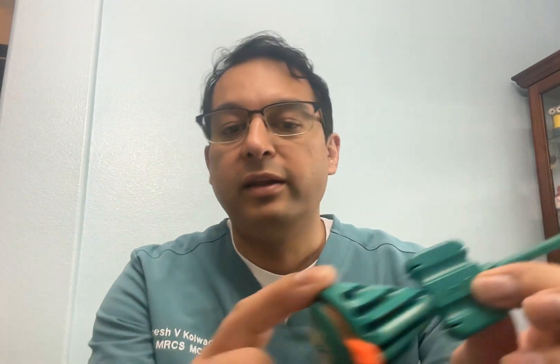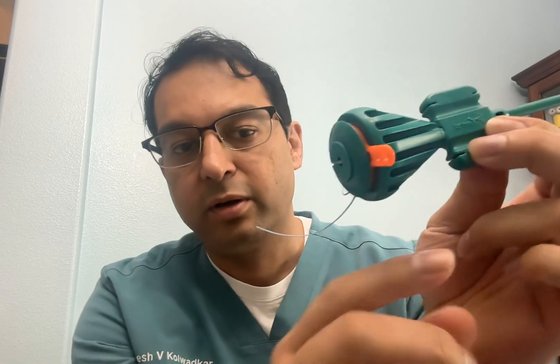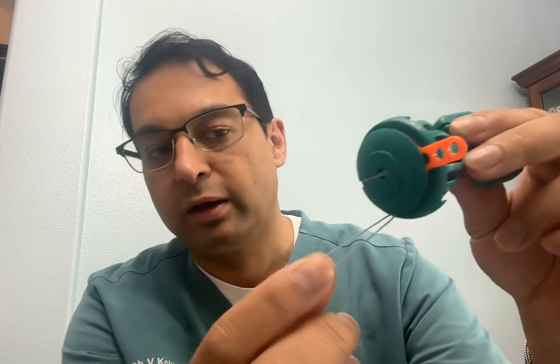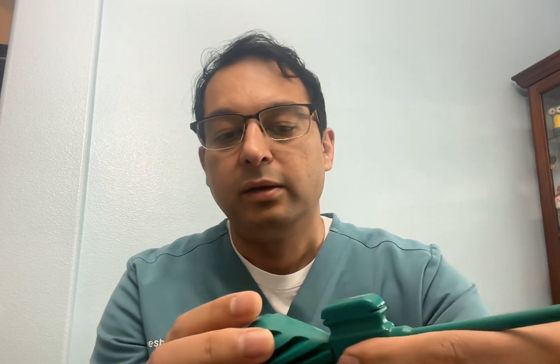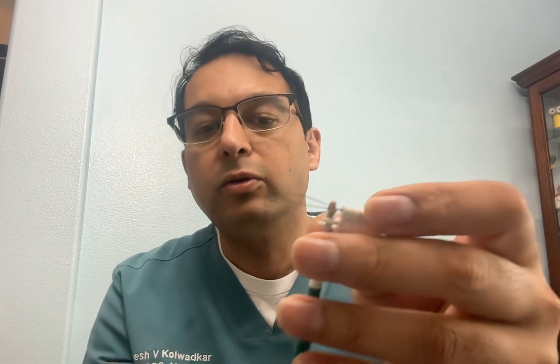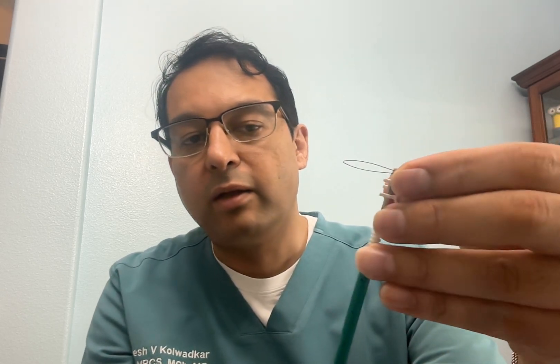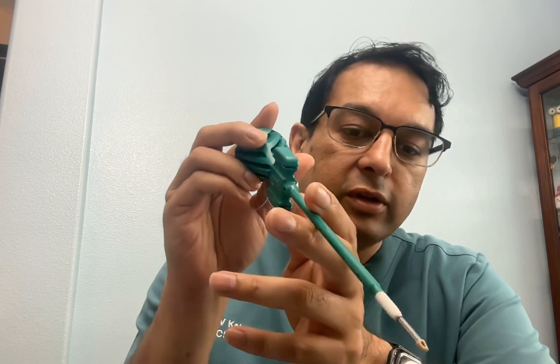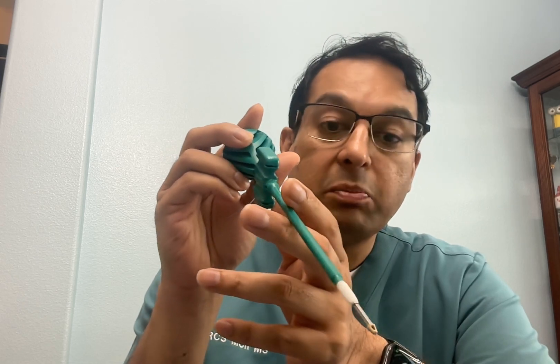There is a pear-shaped handle, and these are the sutures which are wound around it. The sutures are holding this tip in place. You use this loop to thread the suture through the hole.